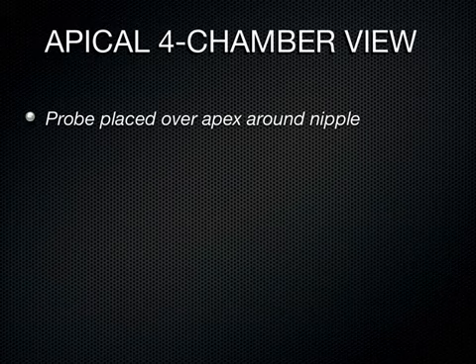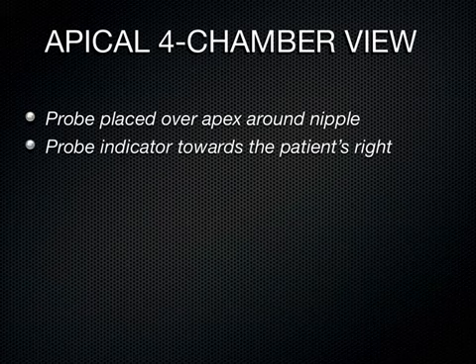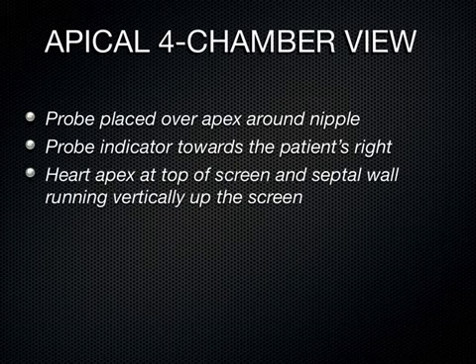It's particularly difficult in women with large breasts because you have to move their breast out of the way to get to this little view here. So this is one you're going to struggle to obtain, but it's the one that gives you the most bang for your buck. You're going to place that transducer just inferior to the nipple line and lateral, in that area by the nipple, with the indicator to the patient's right.